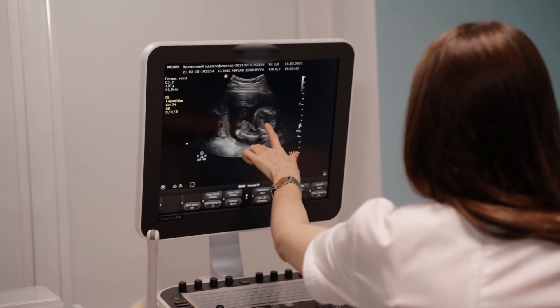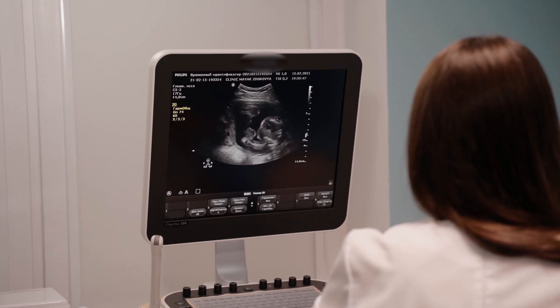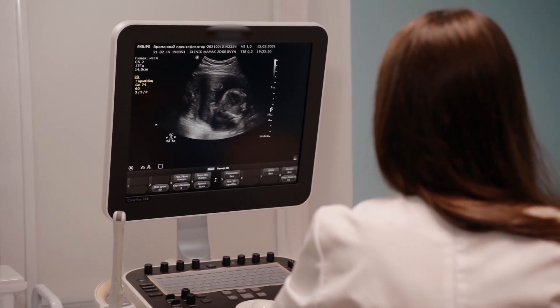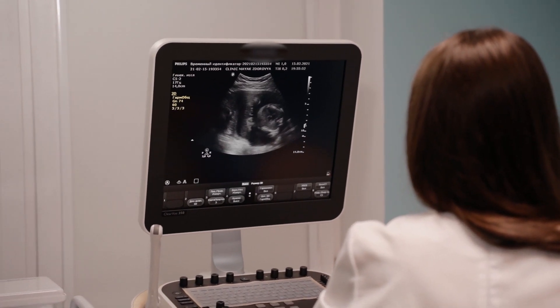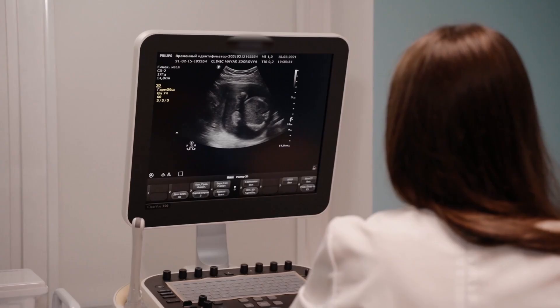Ready to rumble with the most powerful portable ultrasound machines? Choosing the right one can feel like a medical mystery, whether you're a healthcare hero or a student in training. But don't worry, because in this video we're revealing the best portable ultrasound machines of 2025. Get ready to make the perfect pick!